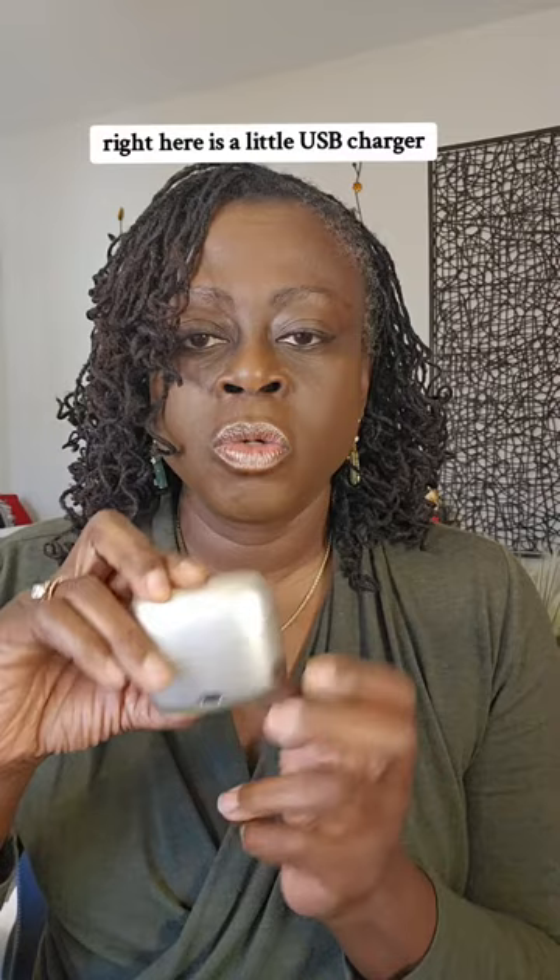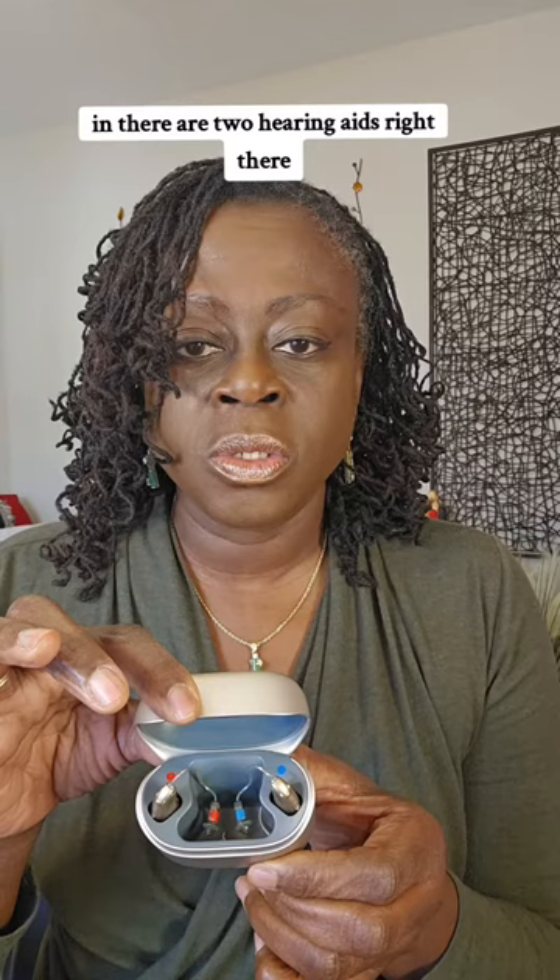I know I'm rambling. So this is the case that it comes in. Right here is a little USB charger, and this is the case. Open them up — inside there are two hearing aids right there.